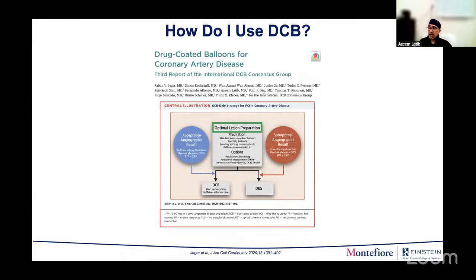angiogram, because I have had cases where, because we're just doing balloon angioplasty and there's no stent, the wire may be holding a dissection flap up, and by pulling it back, I actually see that. I also see less effects from spasm from the wire. So that's the way I do it.